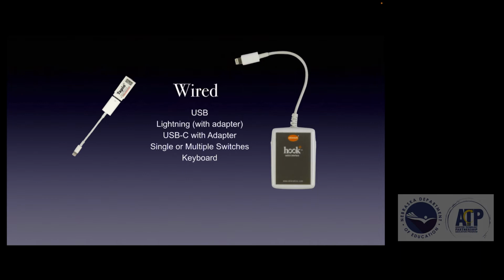Now you'll look at the hook here. The hook has a straight plug-in with a lightning connector into the iPad. It doesn't work with the newer iPads, because the newer iPads, the iPad Pros, have the USB-C plug-in. You can use a single switch or multiple switches. Most of them have some sort of adapter that will allow you to use multiple switches. You can also use an external keyboard. If you have an external keyboard, you can use some of the keystrokes to access and control switch control if you want to also.